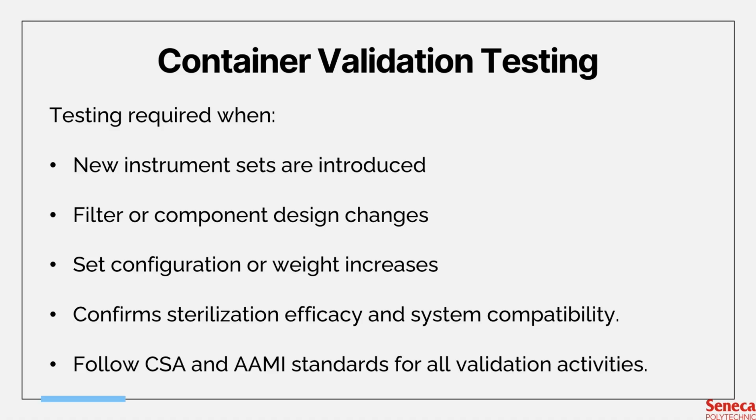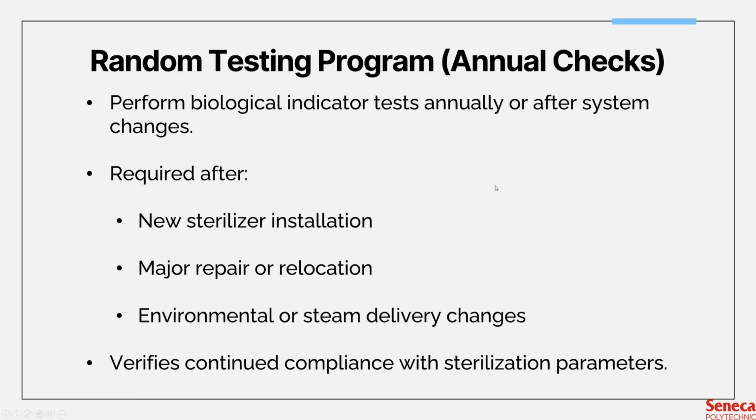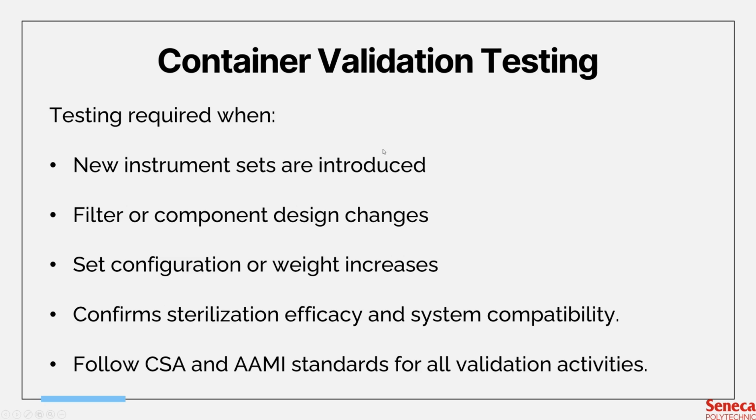So if for some reason you are the coordinator and there's a new instrument set required or asked for by a surgeon, so they want it to be in circulation, you would have to put them through validation testing, especially if they're using rigid containers as their main setup.